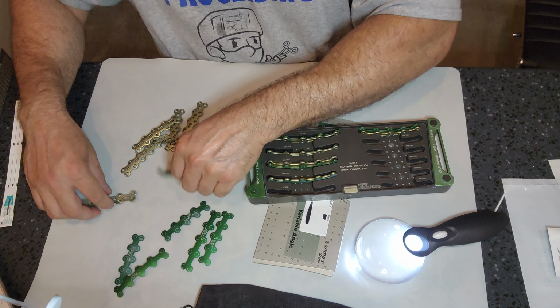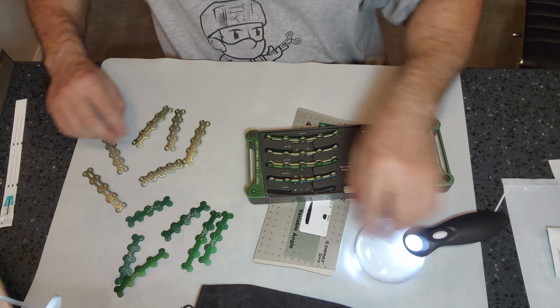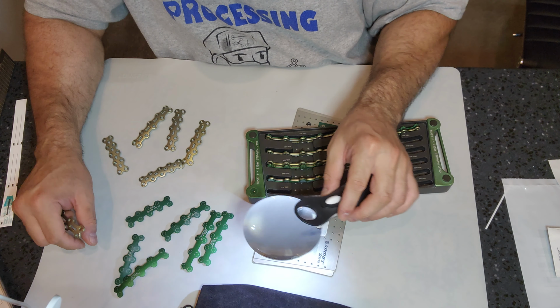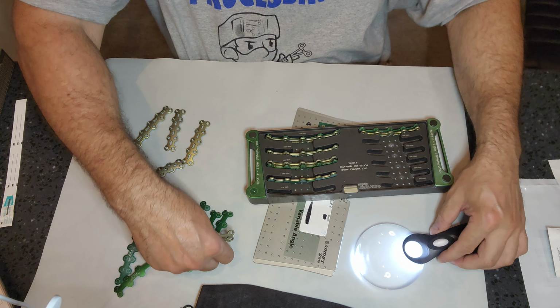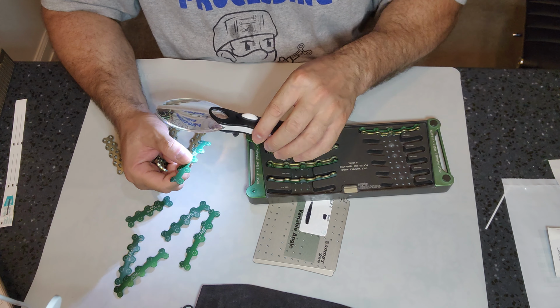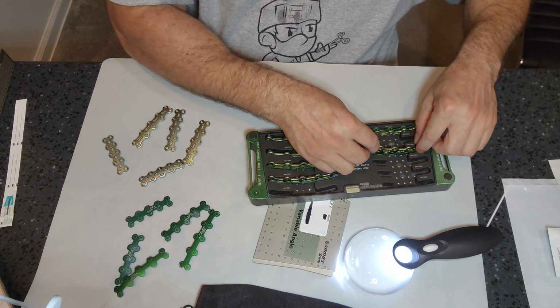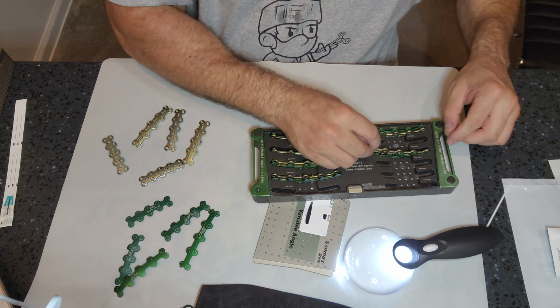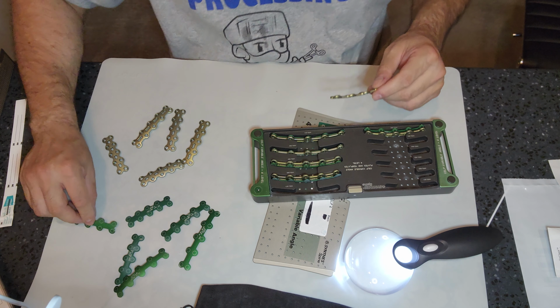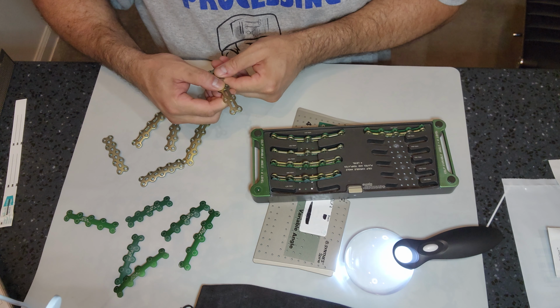I'm going to organize this a little bit better because there's a better way of doing this, right? Inspecting my instrument. This is an 84. My implant is clean, and I'm looking for my 84 trial. There's my 84 trial. Inspect that for cleanliness and any damage. 184. Oh, is that 184? No, this is 187. I got the okie doke on that one. That's a 187. I got taken by that 84 right there in the center. This is an 87 right there.